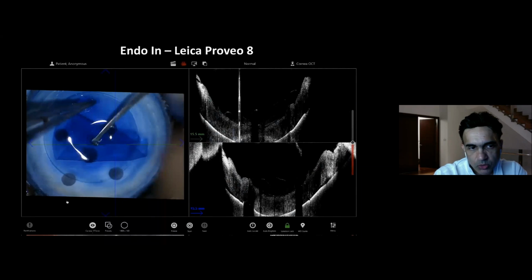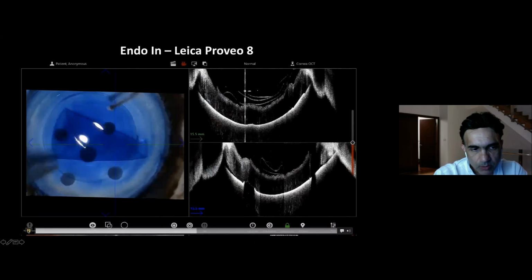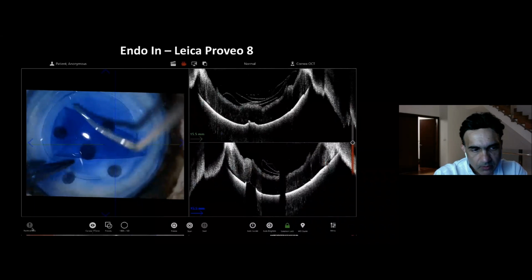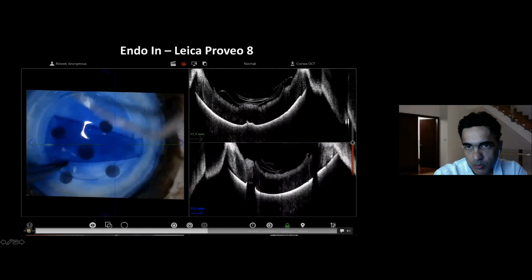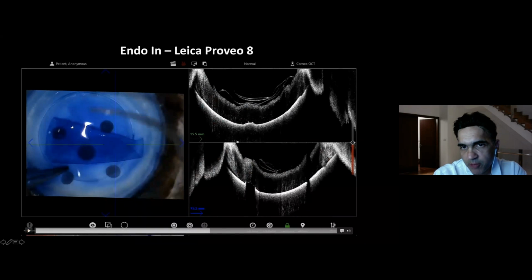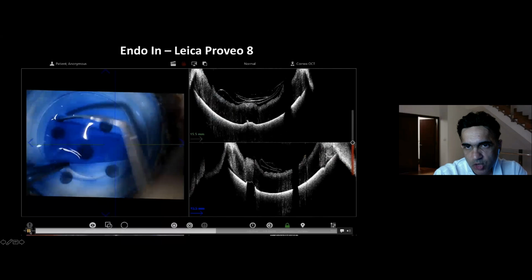As the trifold is being formed, you gently pull over the graft. Let's place a little bit more. There you go. So again, you can see there's fluid in between the two leaves of the Descemet membrane. There's fluid not only between the base leaf and the middle leaf, there's fluid between the top leaf and the middle leaf as well. And then you're ready with your trifold configuration.